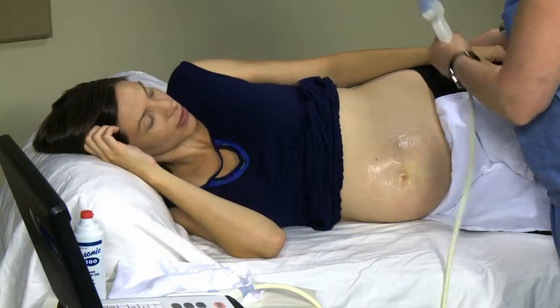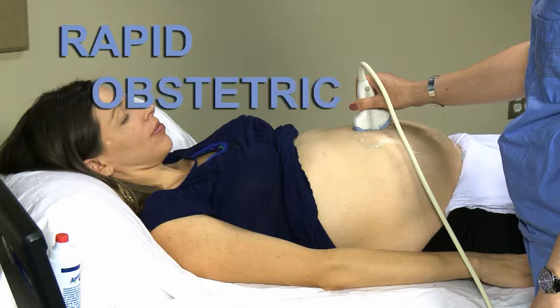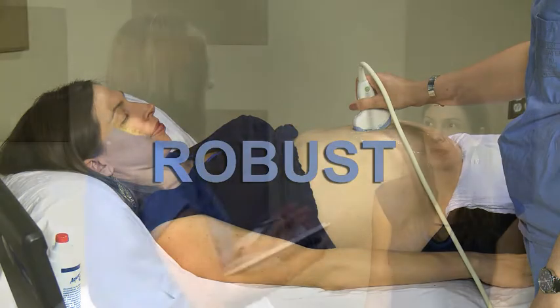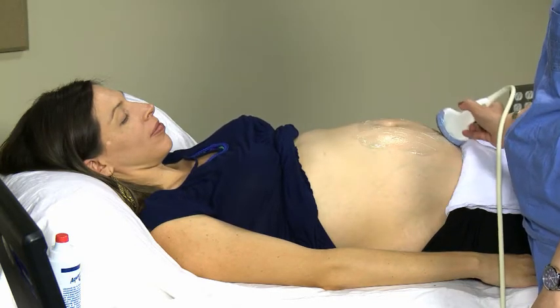You may continue to scan the patient while she is lying on her side. After a few minutes, you may have her lying on her back again to complete the exam. Next, let's see how to start your ROBUST ultrasound exam. ROBUST stands for Rapid Obstetric Ultrasound Survey and is the first step in performing a screening ultrasound exam. Before you begin, always make sure your patient is comfortable and explain the procedure and its safety. With this technique, you can assess fetal position, placental location, and the number of fetuses quickly and clearly.